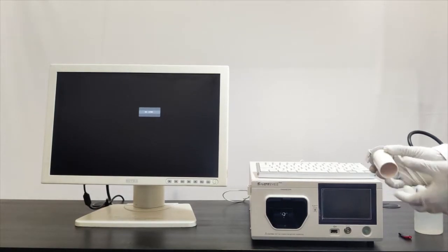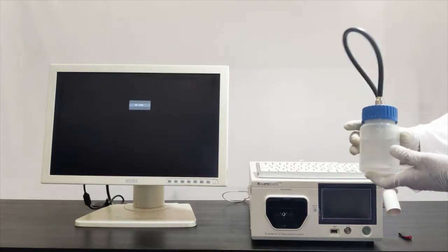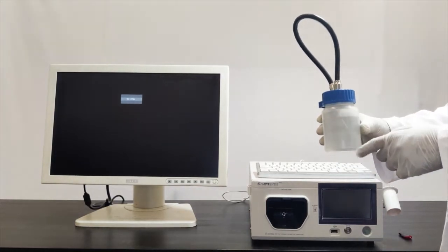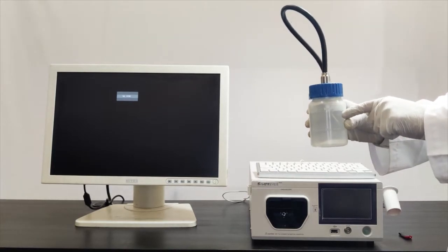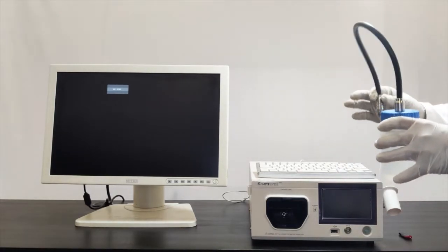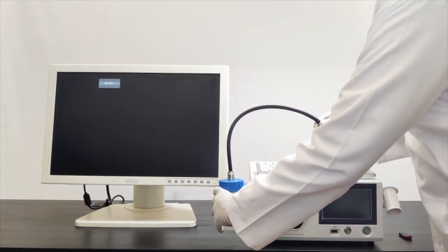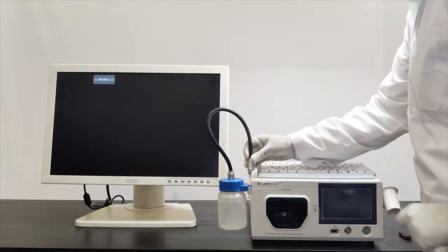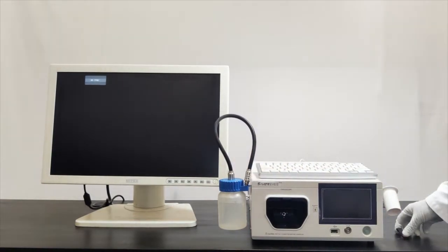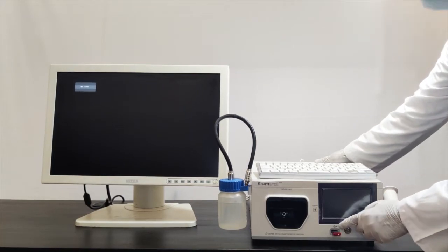This is a white balance cap; I am connecting this white balance cap to the video processor slot. This is the water container — whenever you fill water into this container, make sure to fill it to the maximum marking, and always use clean, dust-free water. I am also connecting an external pen drive to the USB slot.